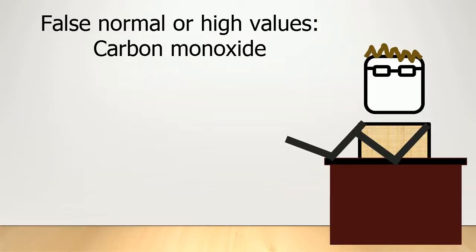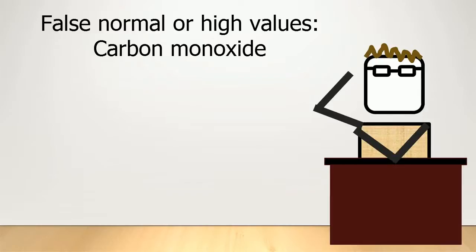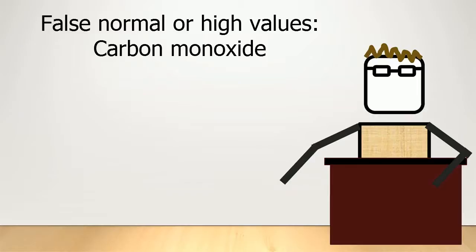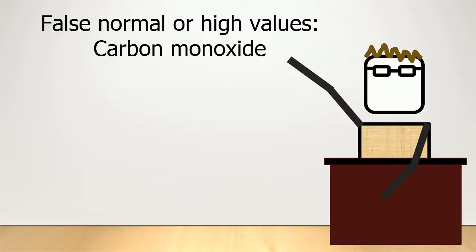So this is a population you need to be aware of, especially the burn victims and people who were enclosed space casualties who are particularly prone to carbon monoxide poisoning. The vast majority of commercial oxygen saturation probes use a wavelength of light that can't distinguish between oxygenated hemoglobin and carbon monoxide poisoned hemoglobin. Therefore, it reads an elevated or normal oxygen saturation even though a large percentage of the hemoglobin is bound to carbon monoxide. Therefore, a significant desaturation can be masked by this artifact.